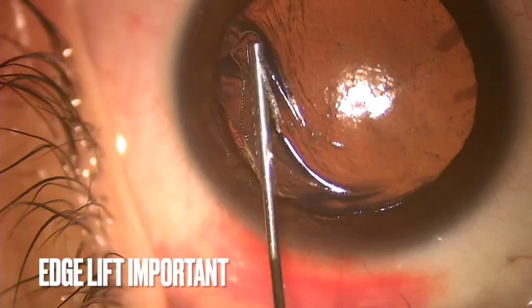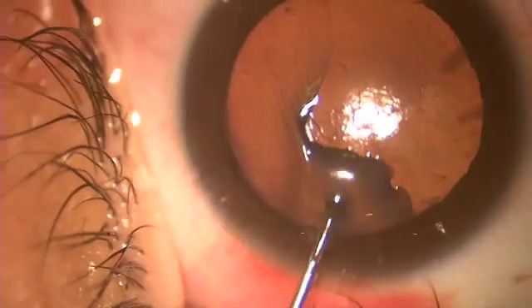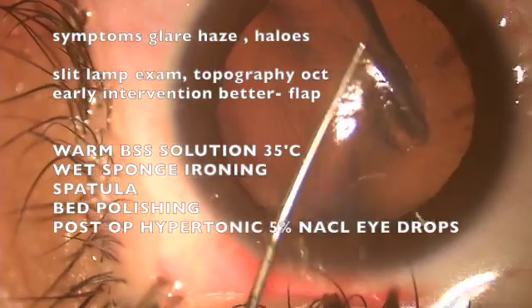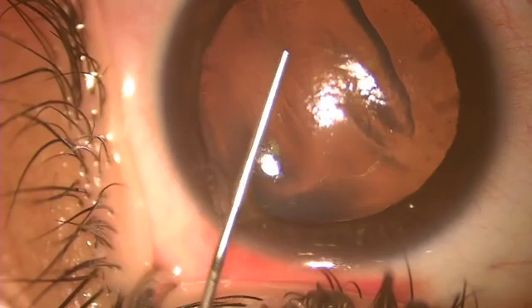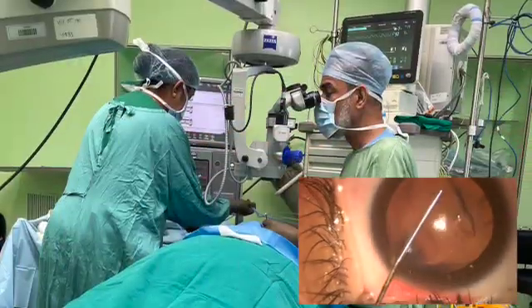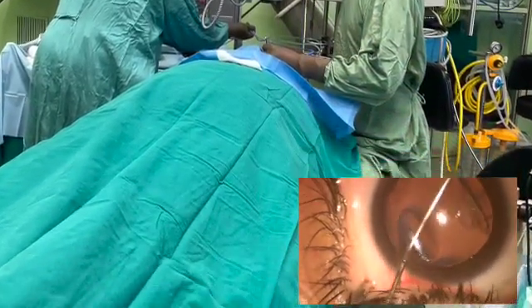So the whole thing here is to lift the flap, iron it out, and do the management as early as possible. We have gone under the micro flap. We are lifting it out. Early identification is very important, and here what we are trying to highlight is use of warm BSS and wet sponge ironing. We have partially lifted the edge, again going in and doing a complete right up to the flap edge.